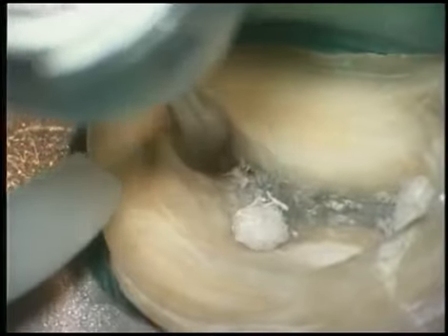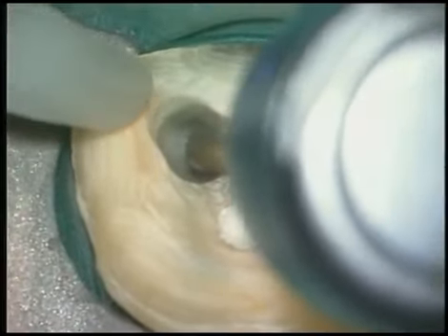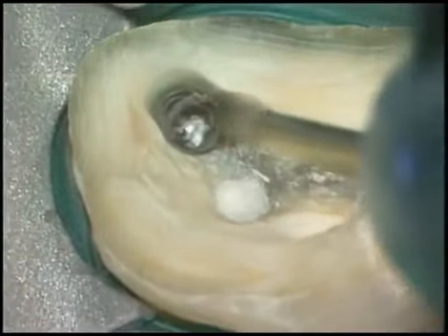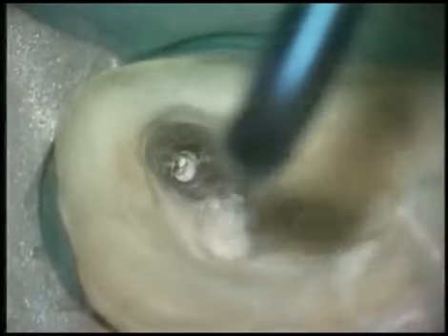Additionally, the belly of the bud can be used on the lateral aspect of the MB canal towards the MB2. This action begins to reveal the groove that typically road maps over to the MB2 orifice. GGs are used small to big, progressively stepping each larger GG out of the canal. This provides an excellent deep view of the broken obstruction.